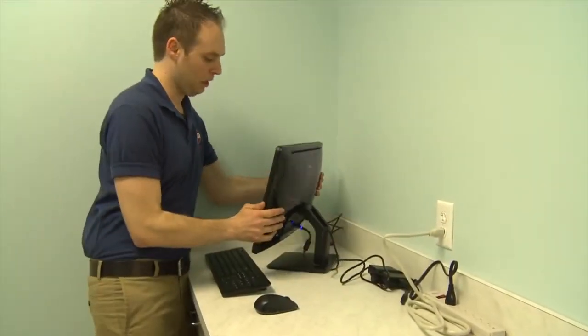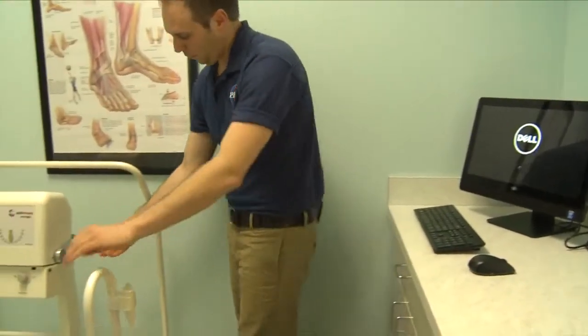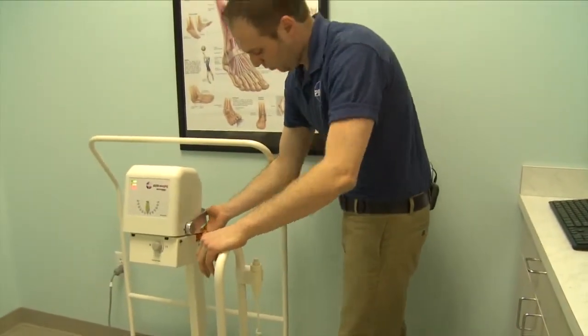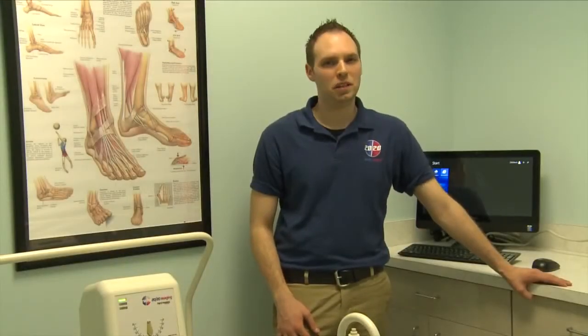Now that we have everything plugged in, we're going to go ahead and power on the equipment. Before we start calibration, we need to set up the server computer.